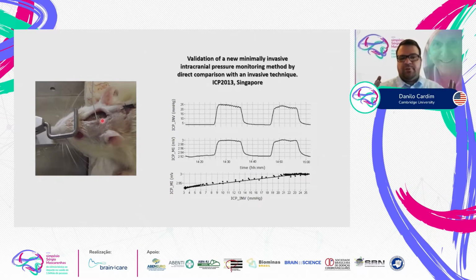And then we would observe the expansion of the skull due to variations in intracranial pressure, concurrently compared with the traditional intraparenchymal invasive intracranial pressure.